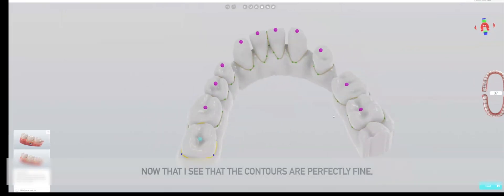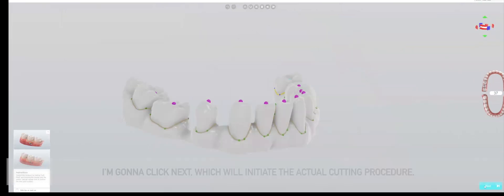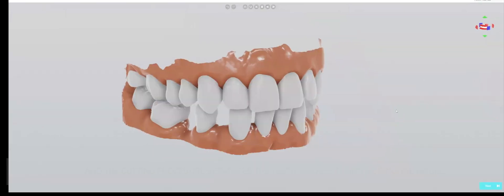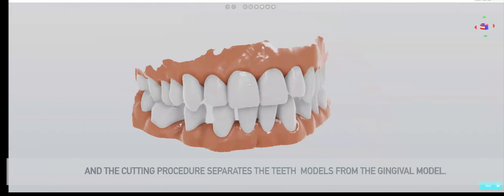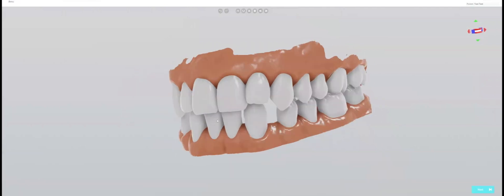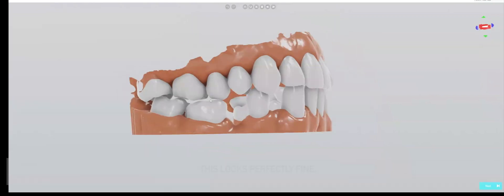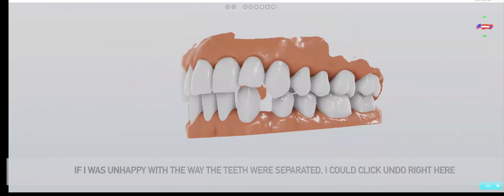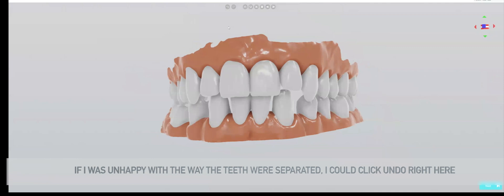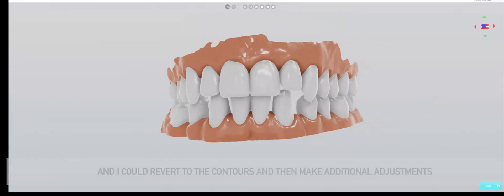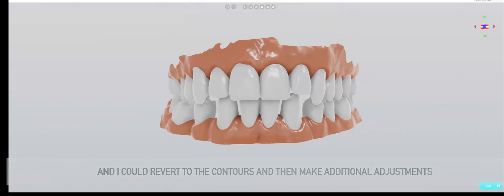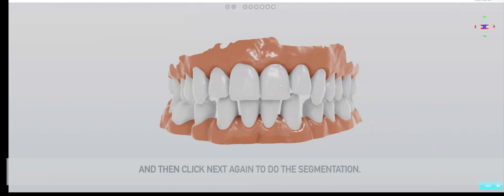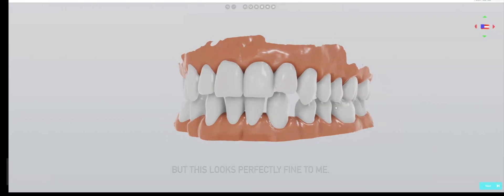Now that I see the contours are perfectly fine, I'm going to click next which will initiate the actual cutting procedure. The cutting procedure separates the teeth models from the gingiva model. This looks perfectly fine. If I was unhappy with the way the teeth were separated, I could click undo and revert to the contours and make additional adjustments.